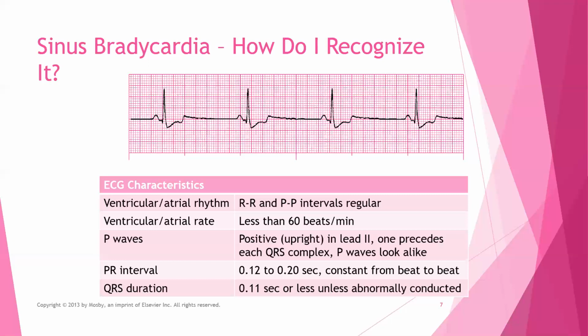See where you have that tip down there? And so the QRS is just those, let's see, 1, 2, just 2 and a little boxes. As it starts right down from that lower point tip, that's where you end that QRS. And as it's somewhat horizontal moving across, that is your ST segment.